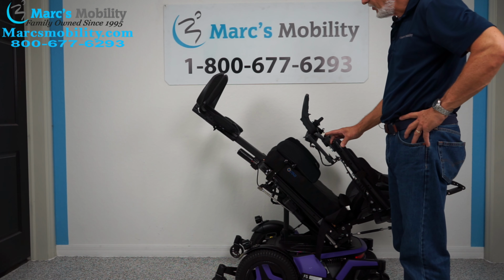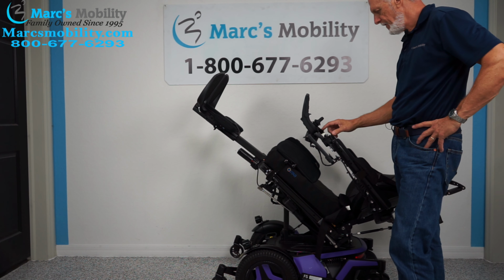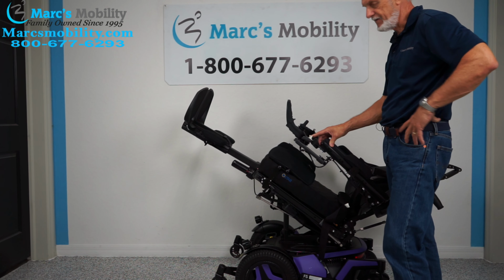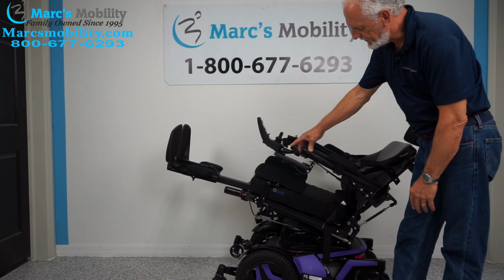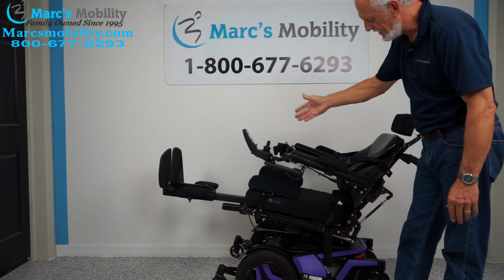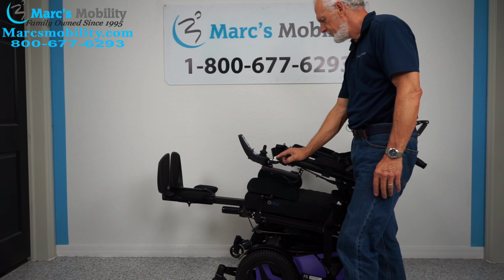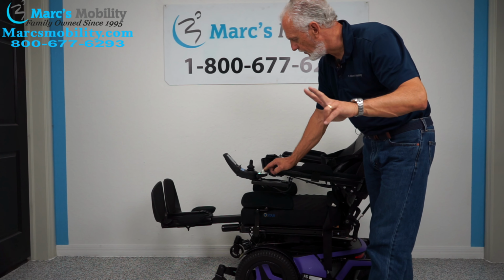All right. So if this is too tilted, too much for you, you can go back down and be halfway tilted. As I said, there's so many different motors on this chair. There's so many different variations of positioning and comfort. So your feet would still be higher right there if you were at this position. So far, we have covered 5 electrical functions. There's still 2 more functions.